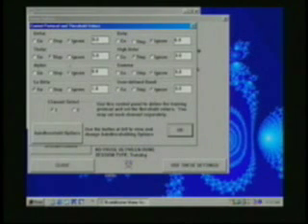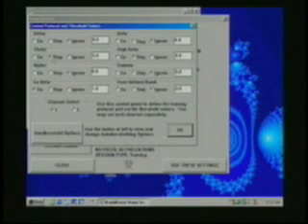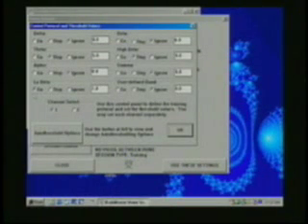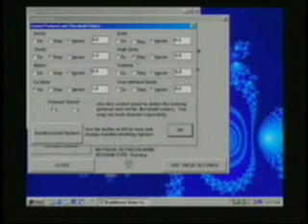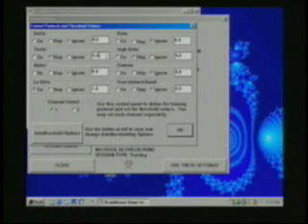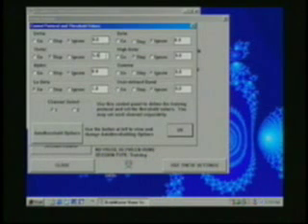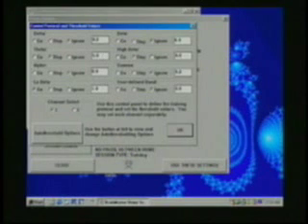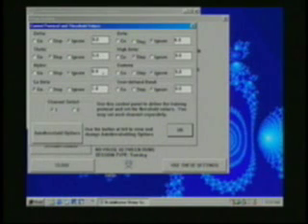For this protocol we see a stop on theta as expected because we're inhibiting theta. We see a go on low beta as expected. And we also see a stop on high beta. In addition, the values typed into these boxes are the threshold values for beginning training. These are appropriate values for typical starting values. And these came with the built-in protocol. So we're going to leave them as is.